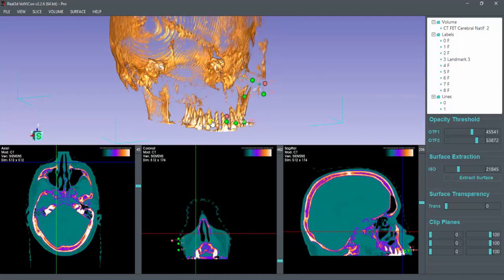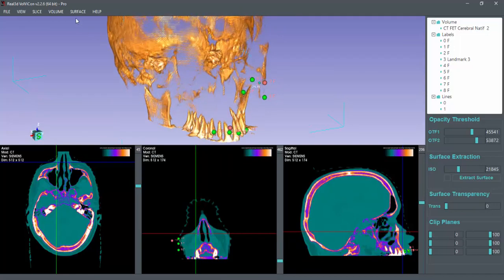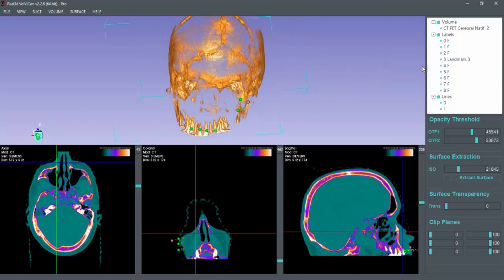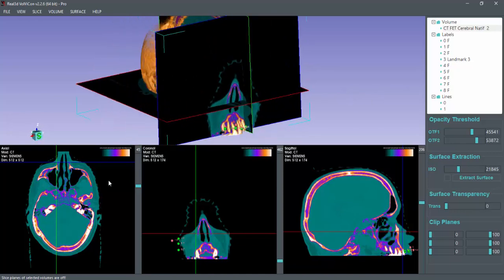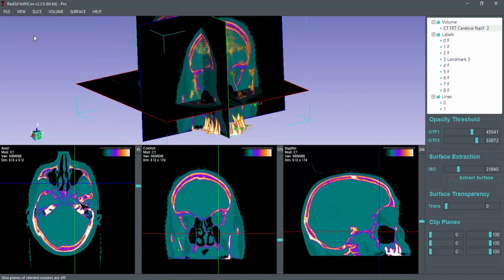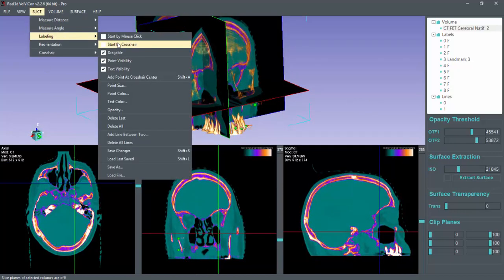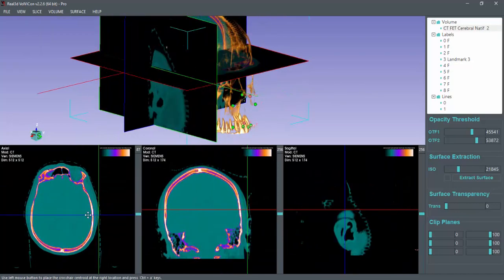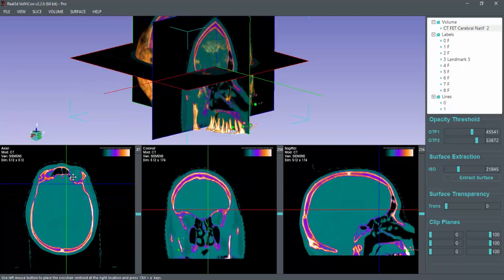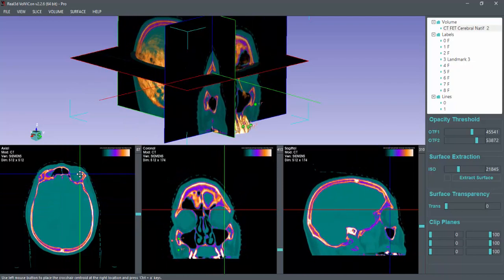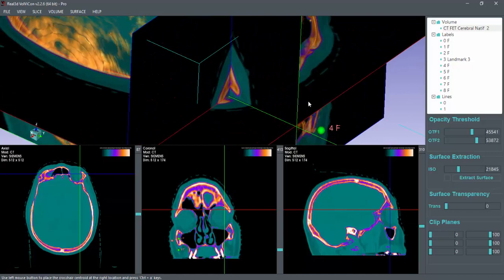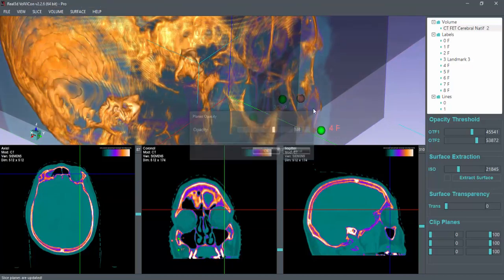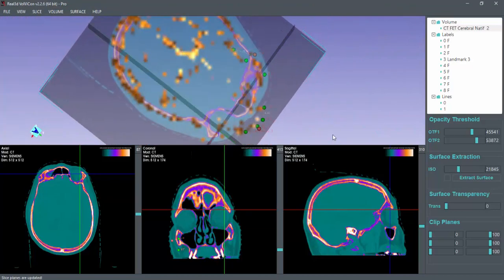You can also enable slice planes when you have crosshair. The crosshair will appear at the center, and then you need to move this crosshair at desired location. You can change the opacity of these slice planes.